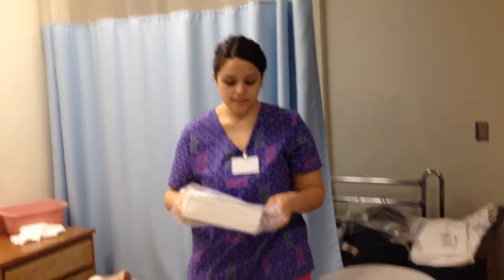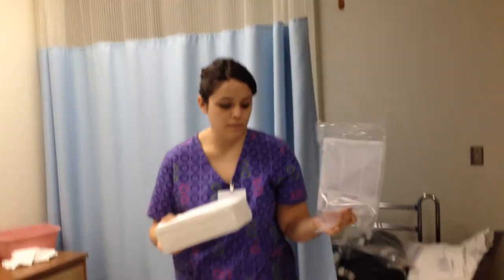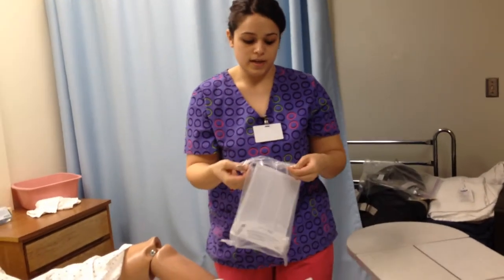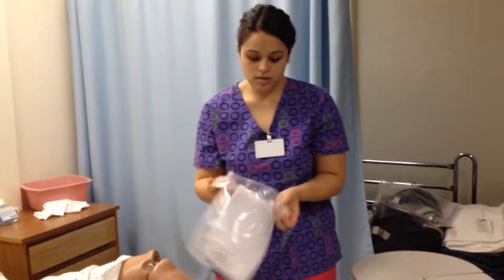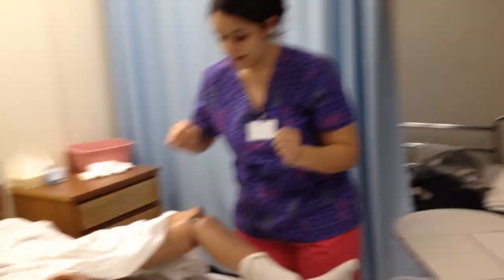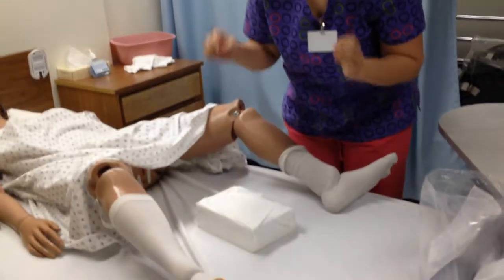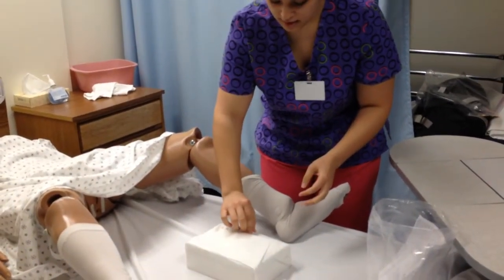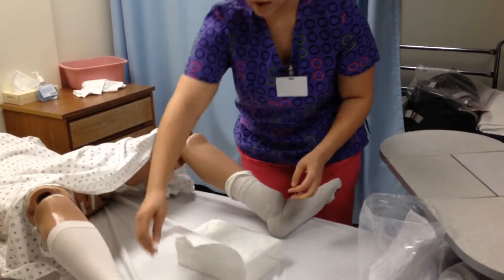To do my Foley cath insertion demonstration, I have my kit here. I'll take it out of the package. I'll use this bag as my garbage. I'm gonna open the package now. Open away from me.